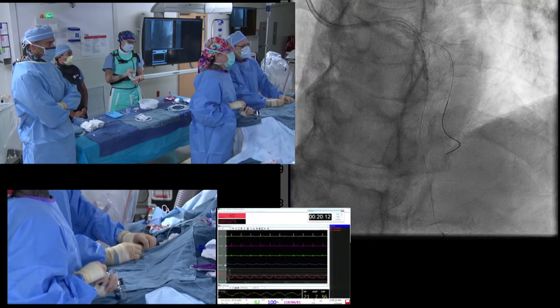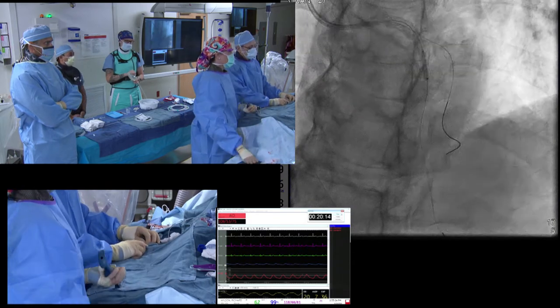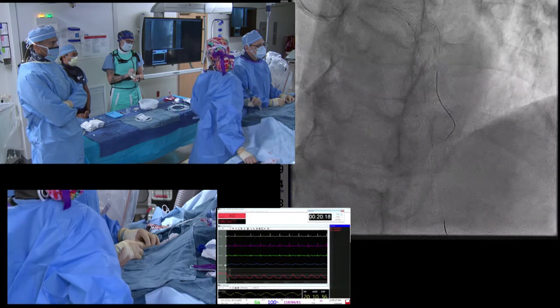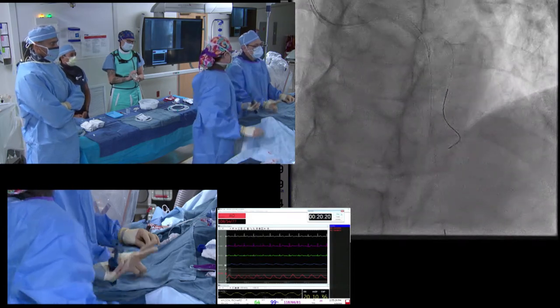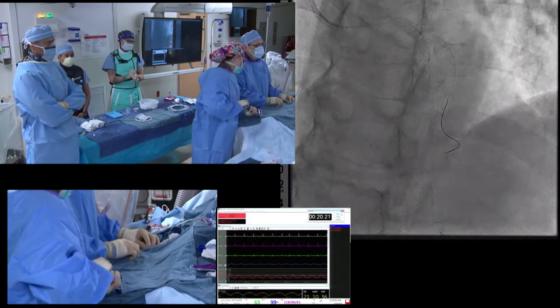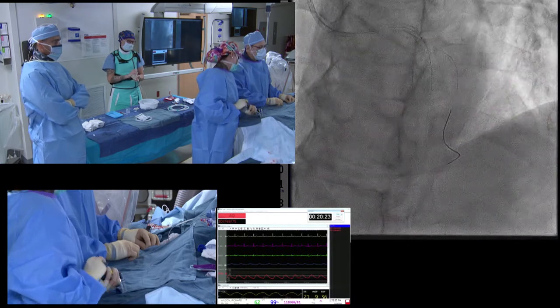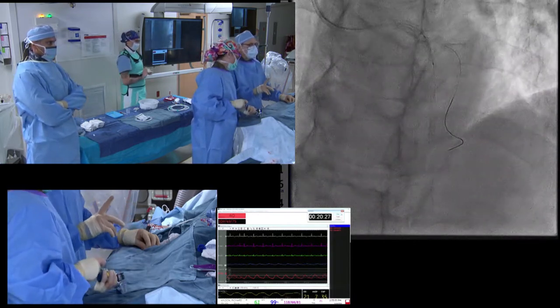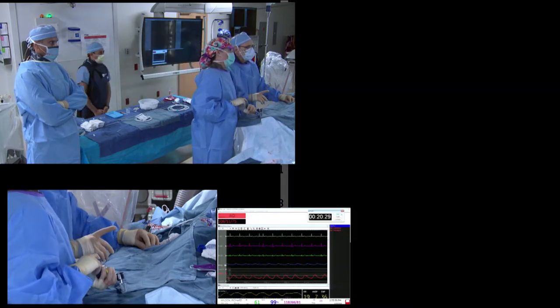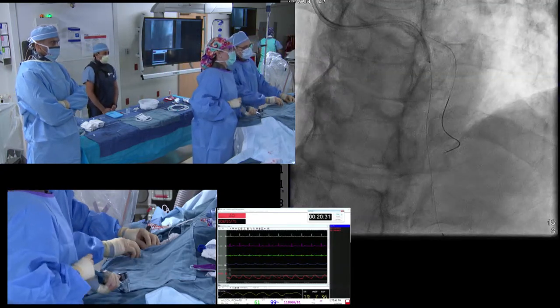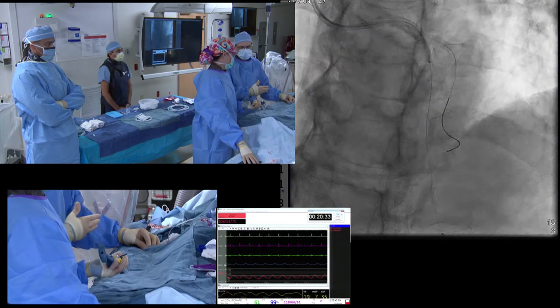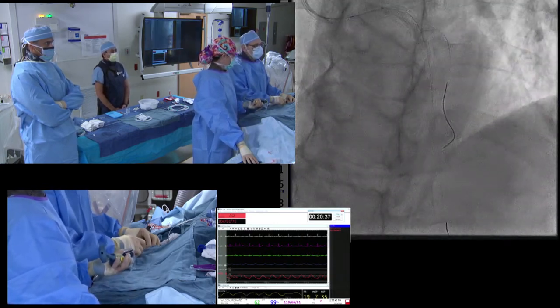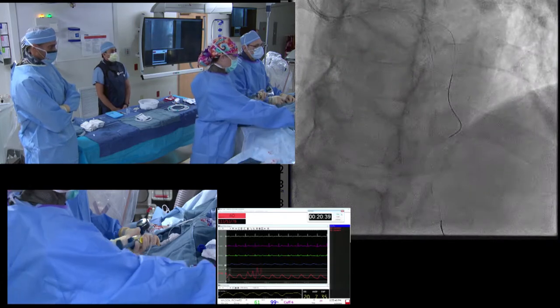As good practice, if your pressure allows, it's good to give maybe 50 micrograms of nitro down the LAD before imaging, since catheters can induce spasm. We don't have tons of pressure — in fact, when we gave the radial cocktail I used a small dose of nitro and verapamil and we were running pressures in the 80s at first.